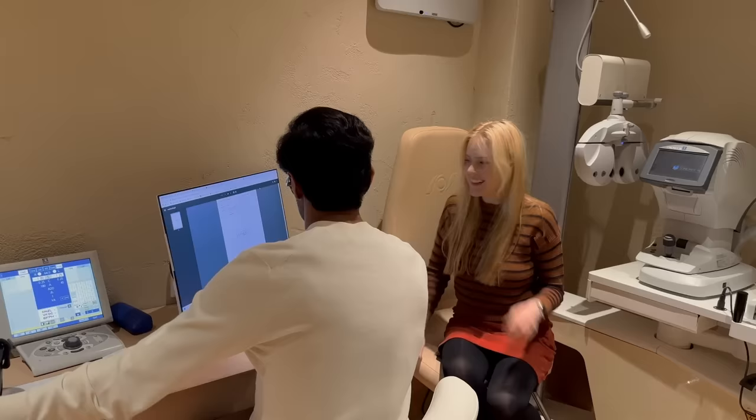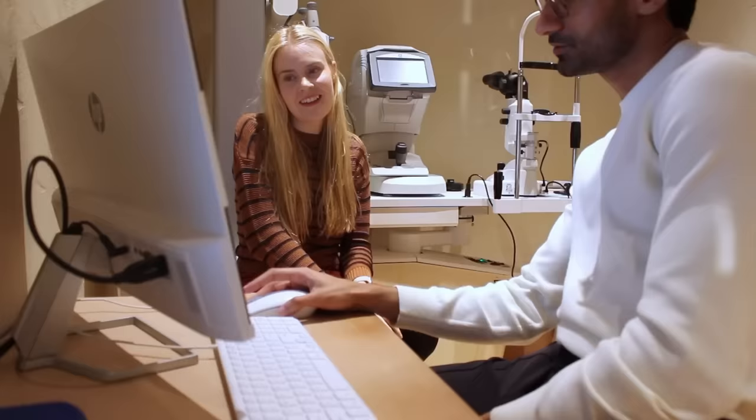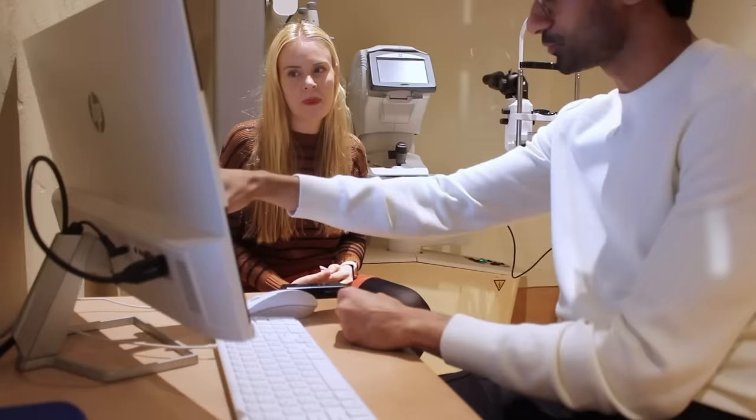You got most of the points. There were just two that you missed in these two points. The main thing we're looking at here is a pattern of loss. So if there was like a big cluster you were missing, then maybe we might be concerned. We could do it again. They were quite random points in completely different spots. And also it's quite a long test, right? So I don't blame you.